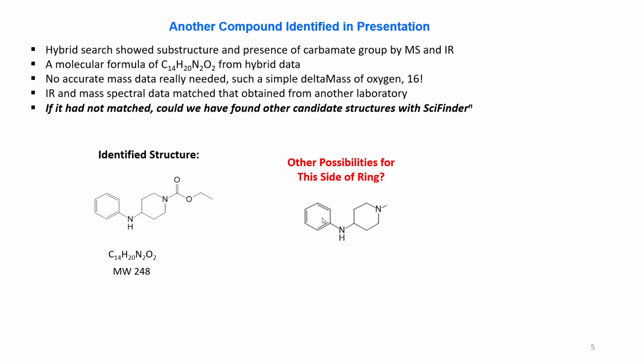And as I will remind you, ChemSpider is free and SciFinder has a fee associated. It costs money. ChemSpider has many fewer compounds, and SciFinder has many more compounds, and is also highly curated. So I go back and forth between both of the applications and sometimes find complementary data that's useful.